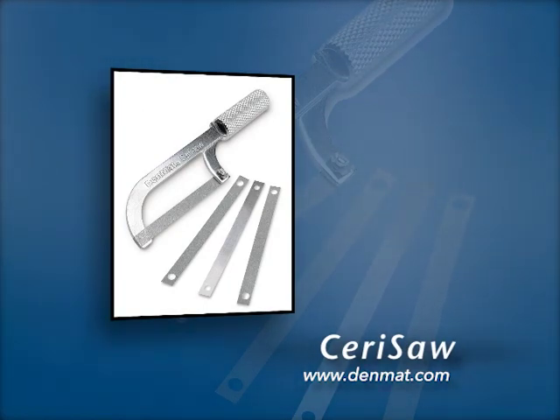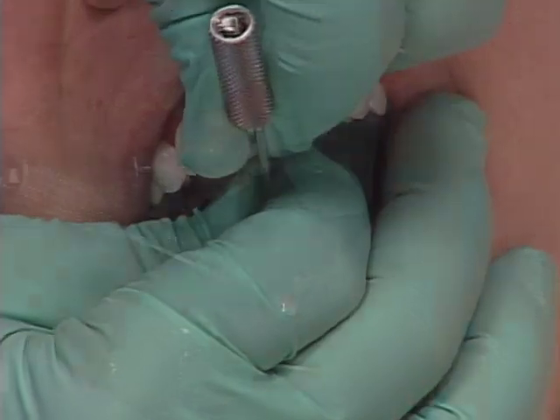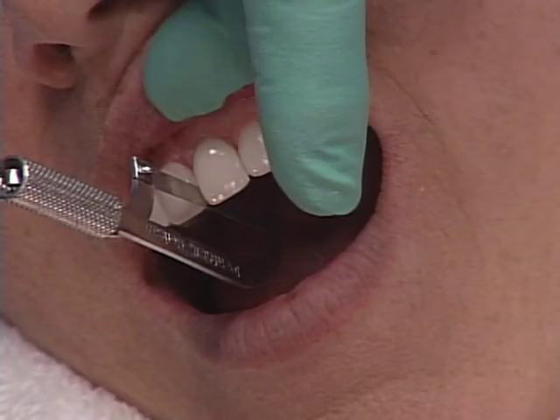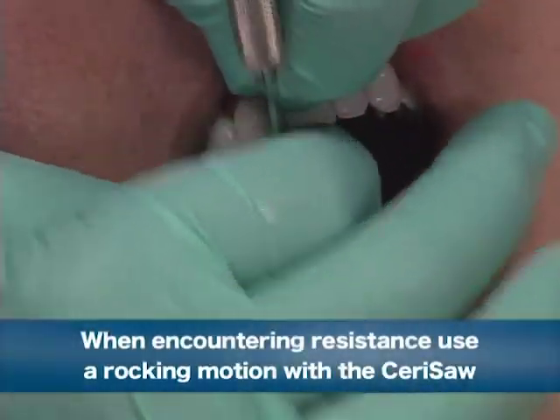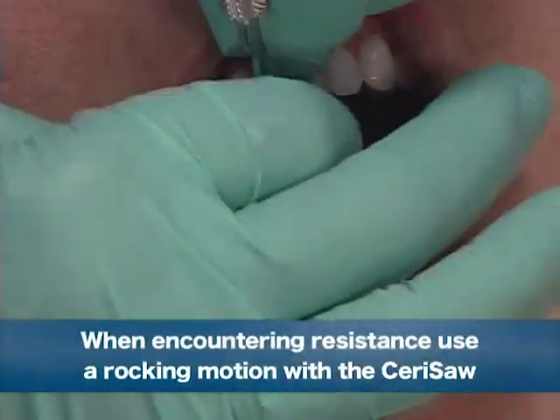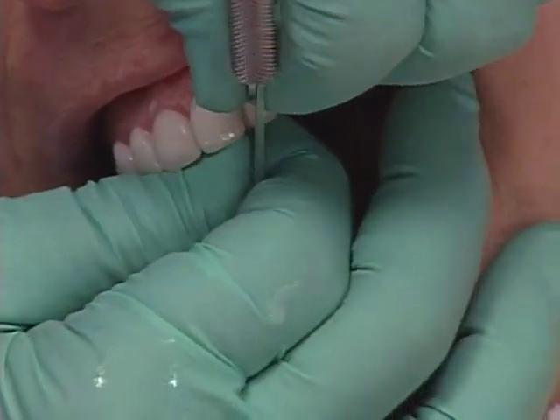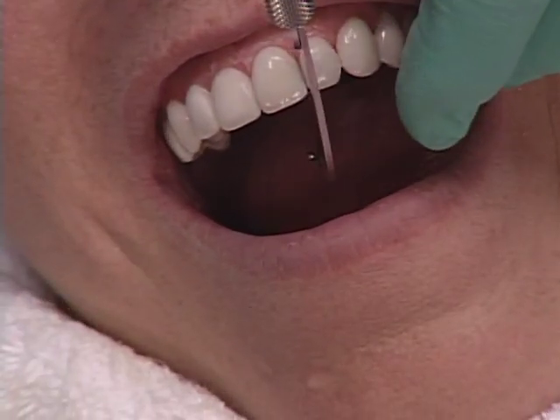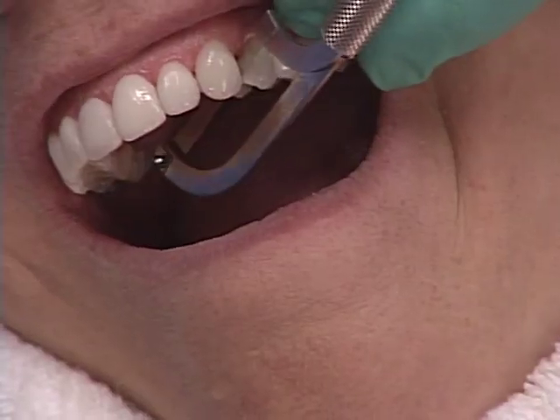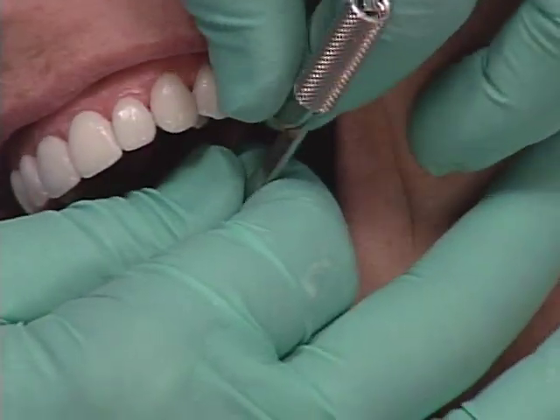This is called a CeriSaw. All right, now I'm sawing and it stops. So don't keep sawing with pressure. If you're sawing and you run into pressure, stop and start rocking. And keep a lot of control with finger rest. Okay, now I'm just going through this next tooth, a little controlled pressure. That one just sawed through. See how these open so easy? But it's only because I got the Ultrabond out.